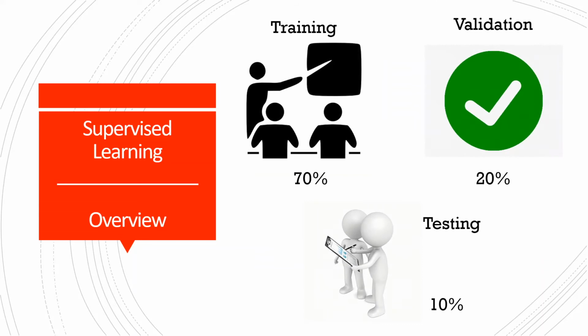In terms of splitting our data between training, validating, and testing, we had 70% for training, 20% for validation, and 10% for testing. In addition, we programmed 15 epochs, but the model itself stops training if there is no major improvement in loss between epochs. This also helped prevent overfitting on the training set.